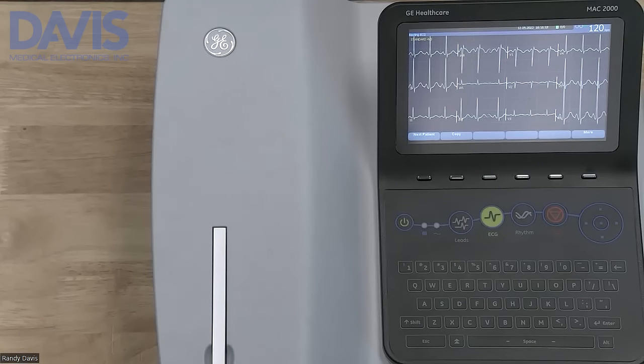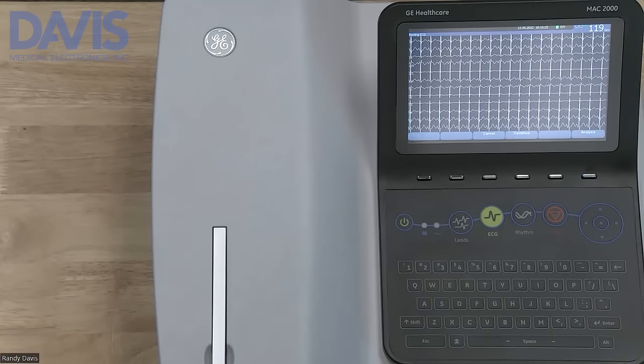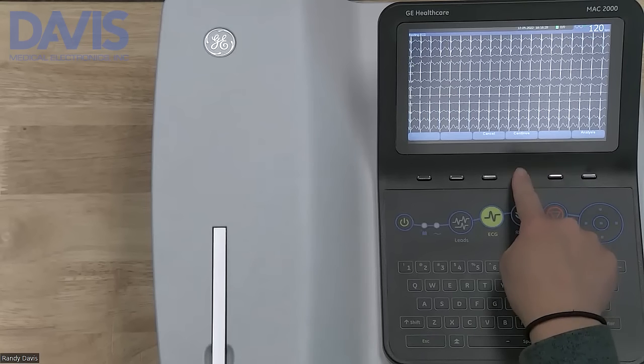Once you're ready to take an ECG, press the ECG key. A 10-second snapshot will show on the preview window. Once you're ready to print, select continue.